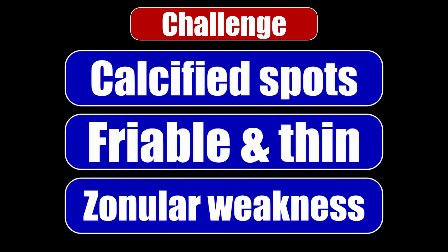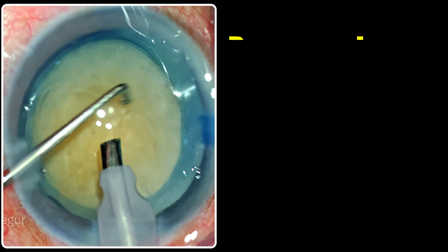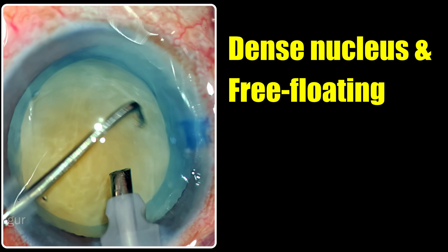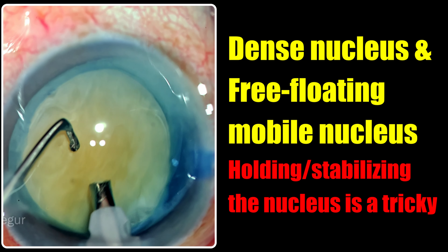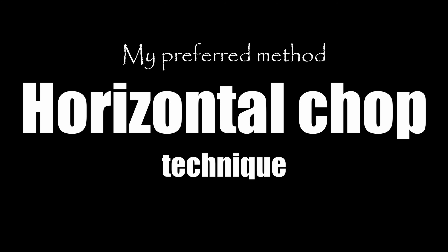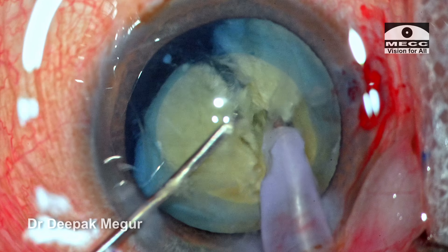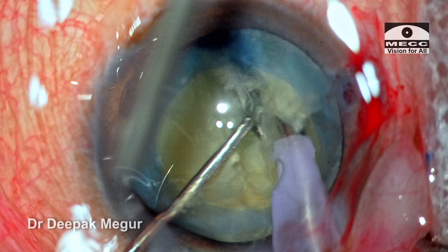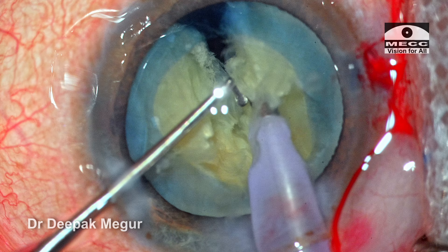Now assuming that we get the rhexis right, we still have nucleus management which is much trickier than a conventional case. The nucleus could be hard and since it's mobile it's difficult to hold and chop. So we need to use the right strategies. Because the nucleus is mobile, among the two chop techniques available, I would prefer and recommend a horizontal chop technique, simply because the direction of movement of the chopper is much more physiological and you're more likely to get the split effortlessly without complications compared to a vertical chop.